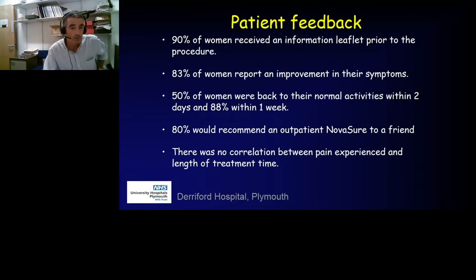So we've done a number of audits. Our first audit was looking at patient feedback and how they perceived the procedure, and 90% of women did get an information leaflet, so they knew what they were having. 83% of women had an improvement in their symptoms, either becoming amenorrheic or a significant reduction in bleeding, which was reassuring. 50% of women were back to complete normal activities within 2 days.